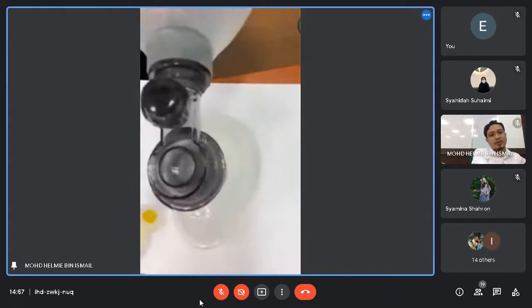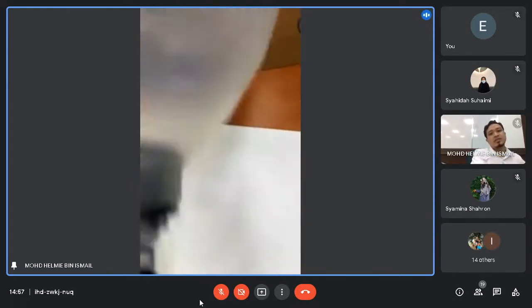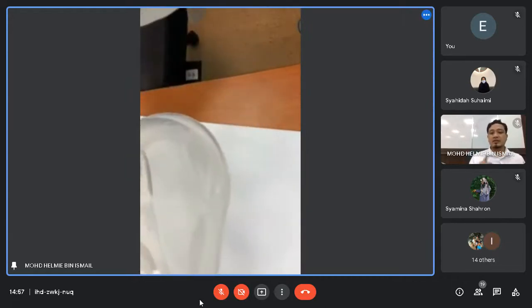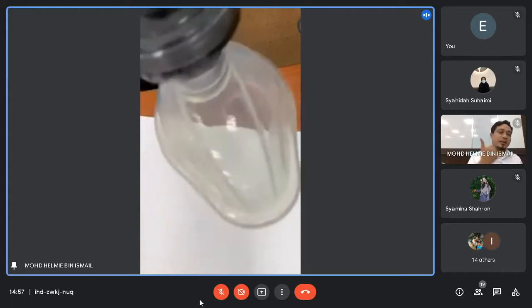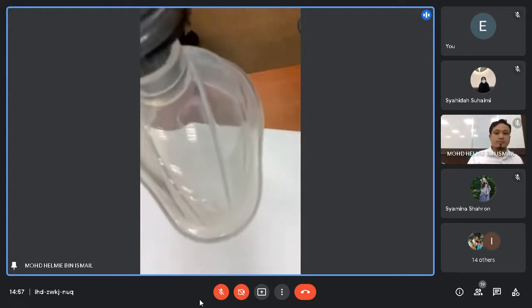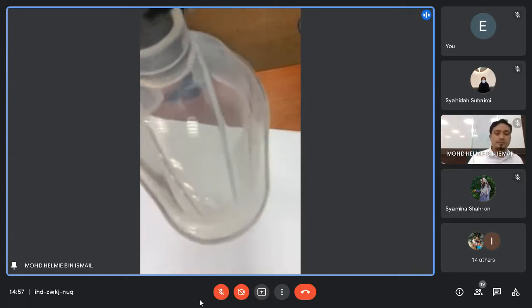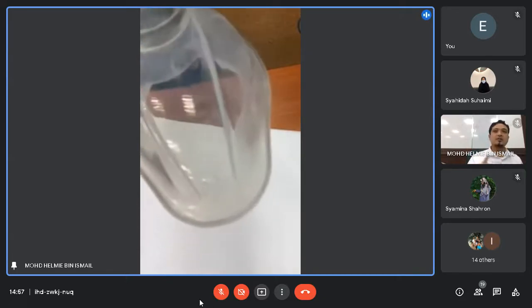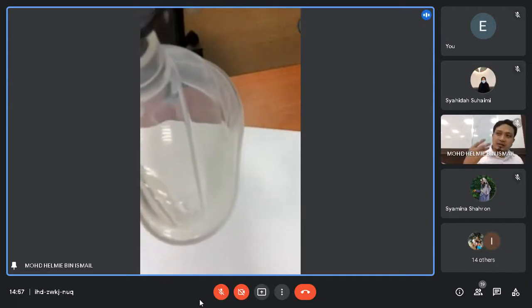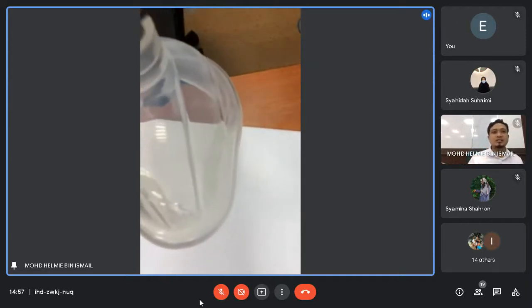Alright, when you are bagging, actually you give positive pressure ventilation, in patients with apnea, ventilatory problems, type 2 respiratory failure, low GCS, and sometimes during pre-intubation.